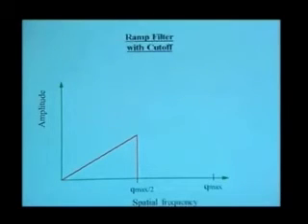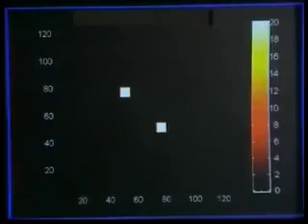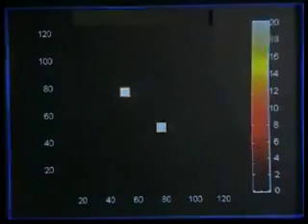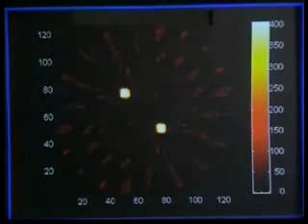Now let's see what we get when we apply this filter to the back projections we saw earlier. Here we have the two original objects, and here is the filtered back projection. As you can see, we get a much clearer, sharper image. Although it is still not perfect, much of the blurring has been removed.